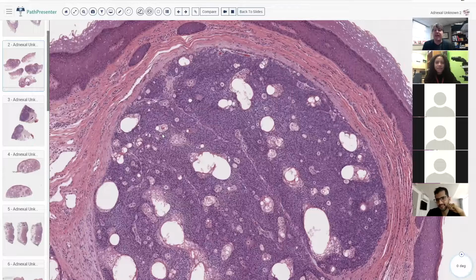And Van Hung makes a very good point that this is a great time to get the diagnosis wrong. Because A, the chat screen is hidden from the video, so maybe your colleagues will see that you got it wrong, but no one on the internet will, okay? And the other thing that is important about this is that if you get it wrong, no one dies and you don't get sued. And I like to tell my residents that, and I'm kind of joking, but also it's totally true. When you're in training or when you're in a conference, it's a great time to look at a case and say, I think this is the diagnosis, and to be totally wrong, because that's how you learn and how you set your internal diagnostic thresholds.